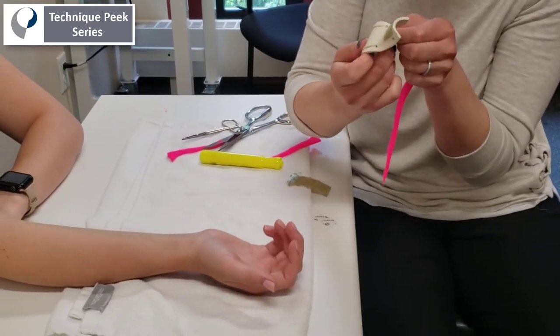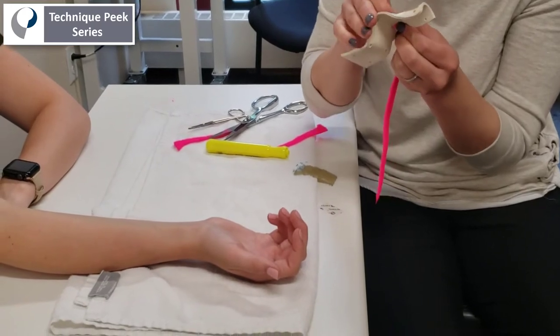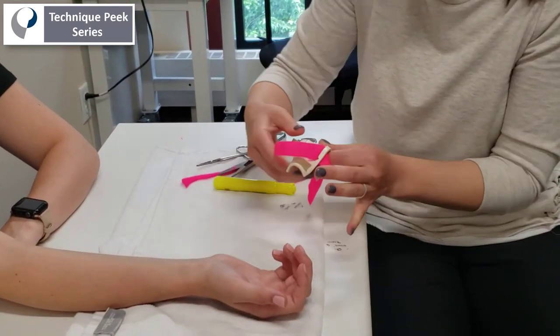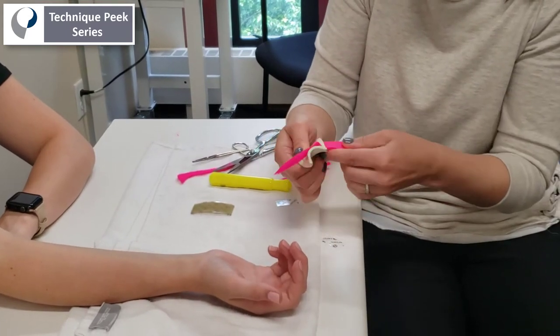I'm feeding in one side of the Velcro strap and I'm going to secure it down to one end of the Velcro loop. It doesn't really matter which end you leave fixed and which end the patient adjusts — whatever is easier for them once you practice a couple of times.